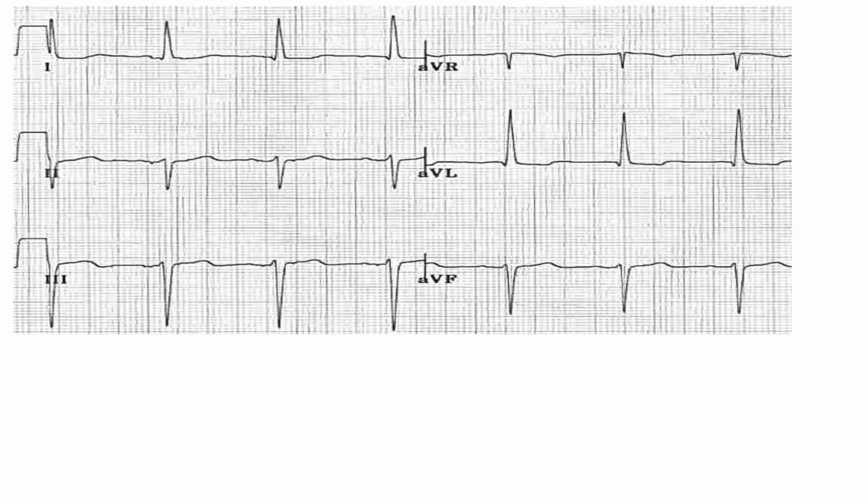As you can see in this ECG, in leads 2, 3 and aVF, you are getting an RS pattern. In the lateral leads, 1, aVL, V5 and V6, at least in 1 and aVL you can see there is a QR pattern. So this is left anterior fascicular block.